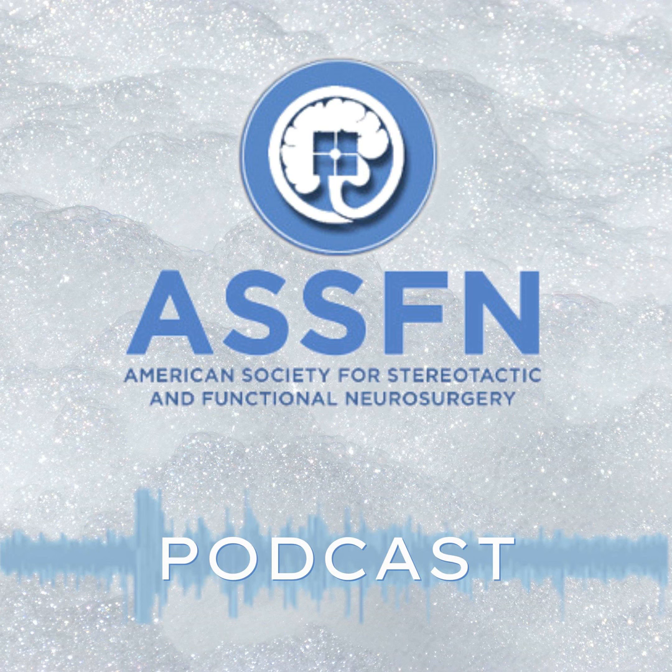I think it's important to think about deep brain stimulation as disrupting abnormal signal as much as you can to the benefit of the patient, but knowing that there's always going to be some disruption of normal information flow, so there will be a trade-off. So what the advantage in concept that the larger GPI target gives you is the ability to stimulate more precisely what you're trying to stimulate without affecting surrounding circuitry.